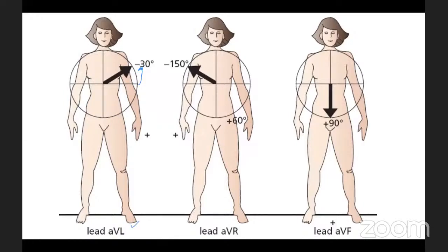Why? Because the heart is negative, and then this is the left arm going this way, from negative to positive. Remember the circuit. And then we have AVR going from the heart is negative, all the way till here. And again, going anti-clockwise is a lot smaller than when you go this way. This one's going to be more than 180, it's going to be 100 something. I don't know how much. We don't want more than that. We just want 150, less than 180, right? So we'll take the negative 150.